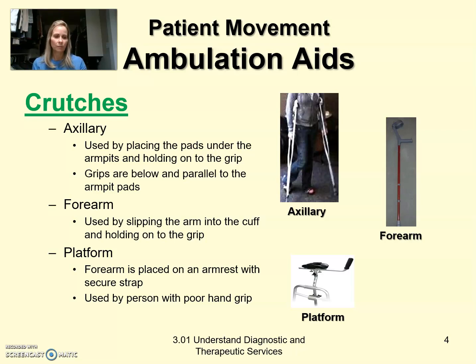Then there's the forearm kind of crutches. And then there's platform. Okay. These are for people that have very weak grips, and they would have this kind of crutch.